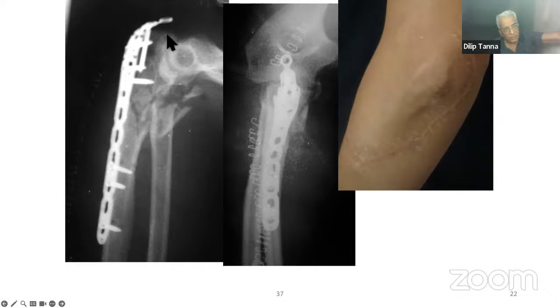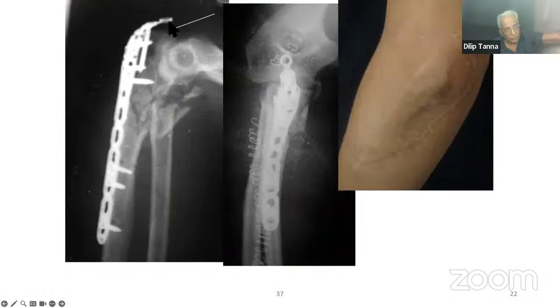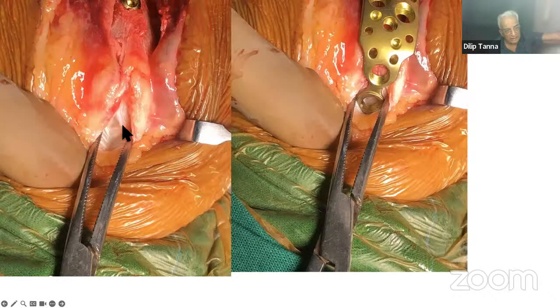This is the incision which I am talking about. If you want to push in, if you want to put it over the olecranon, over the triceps, it will always be like this. So in order to put it back, I cut the triceps, I put the plate underneath the triceps and push back the triceps. This is the way in which the plate will be right underneath. So here is the one.